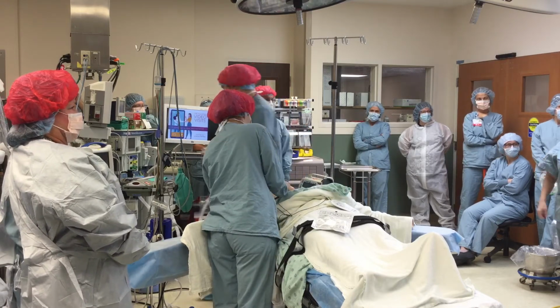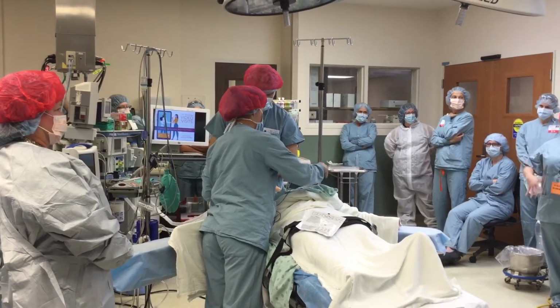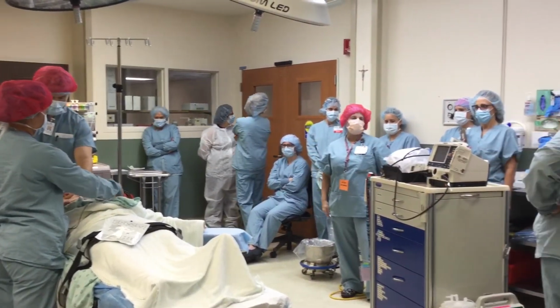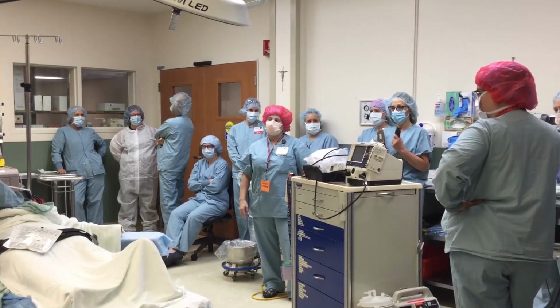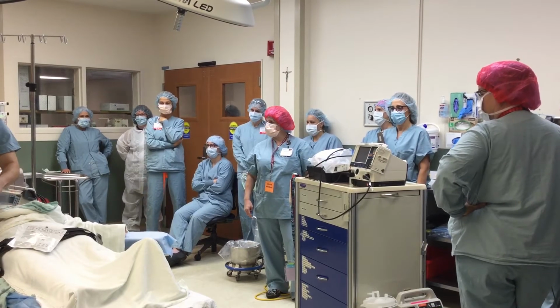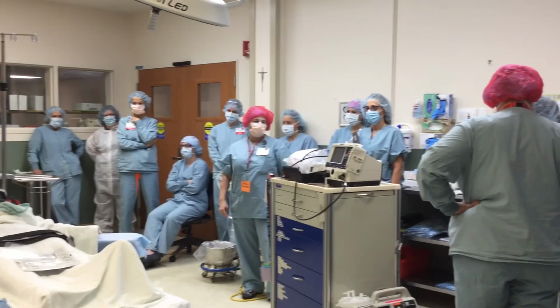So you're gonna call for help? Crash cart is already in the room. No, you're gonna call for the crash cart, so kind of let it play out. Okay. Go blue button, go, start up. Oh, look, the pulse ox is 96. Actually, it's reading room air, 96.